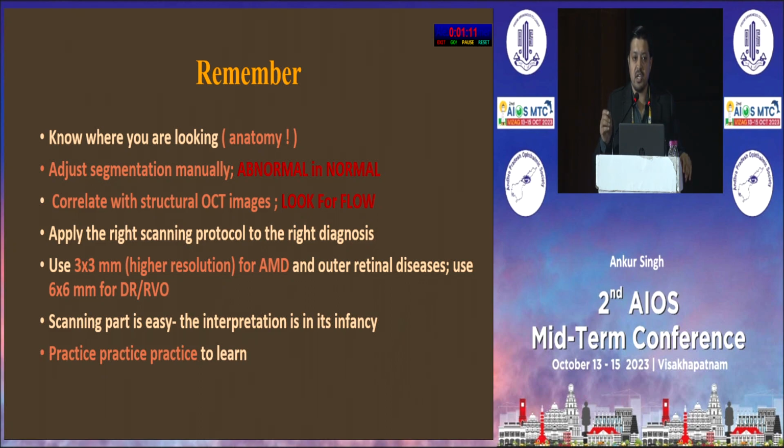Always look at the segmentation. Faulty segmentation, faulty results. Correlate your structural OCT with the en-face OCT, because one thing cannot be interpreted without the presence of the other. Use the right scanning protocols.